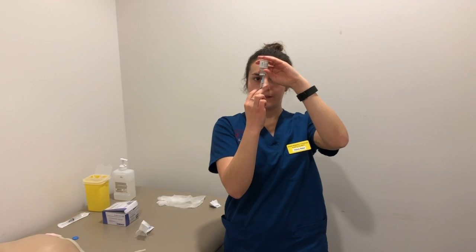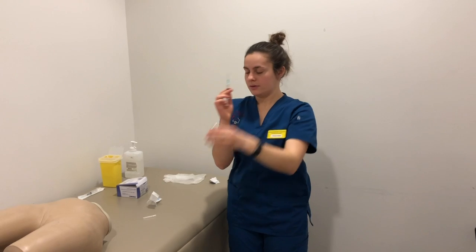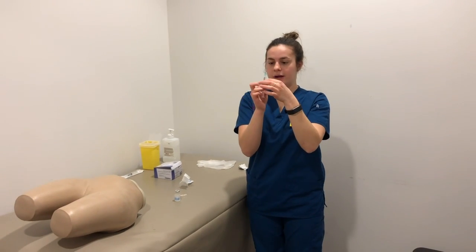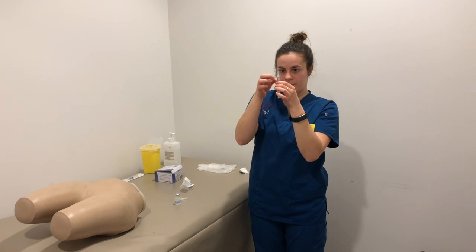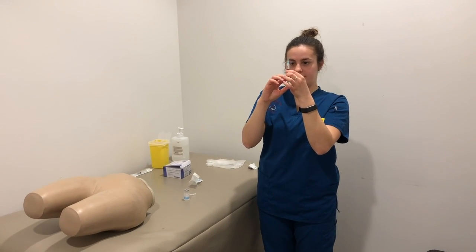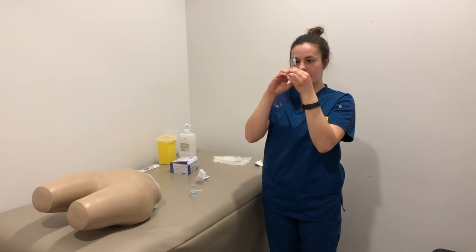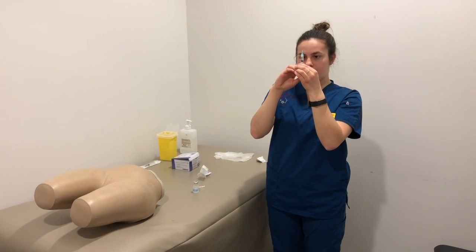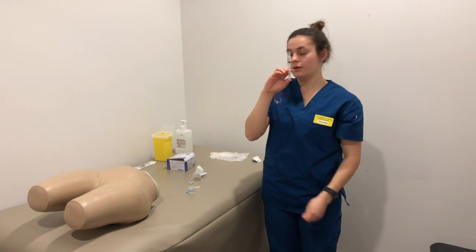Okay, so I'm going to pull out of the vial and tap for air bubbles. And then I will be injecting up to the level, or pushing up to the level and injecting any air bubbles or extra that I may have. So there I have the vial set at 1 ml.